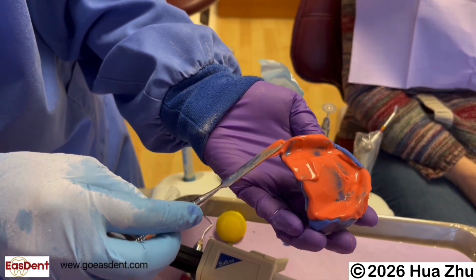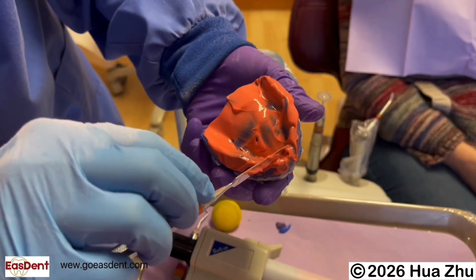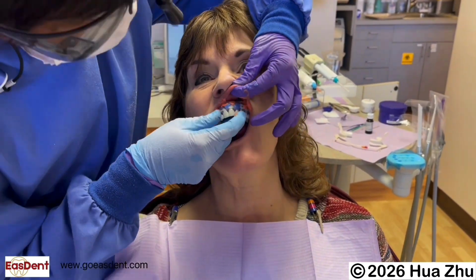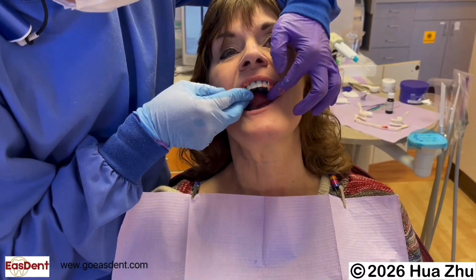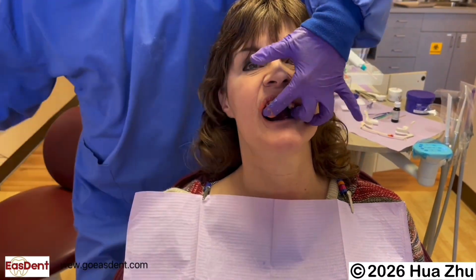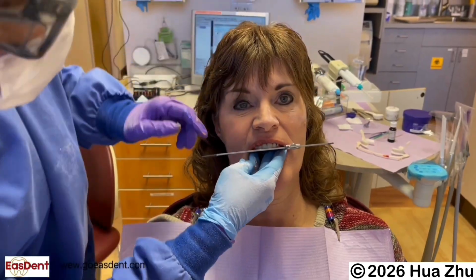It may also be difficult to seat the tray back to the correct position, which can cause Easdent teeth to be moved to a wrong position. Seat the tray in the mouth. Make sure it seats all the way down. The teeth should be at the same position as previously set. They might be pushed down a little bit due to the material thickness.